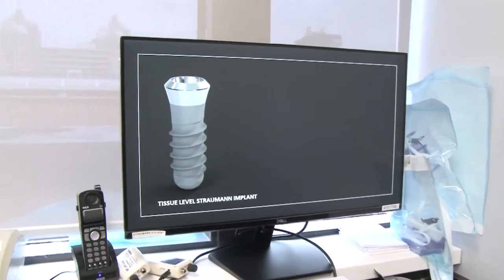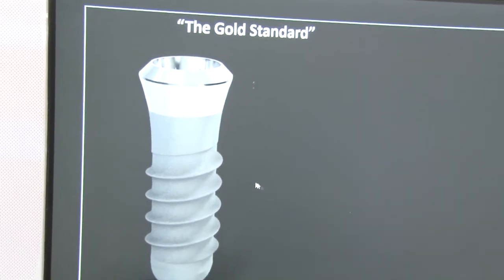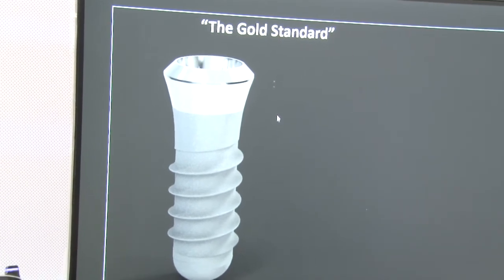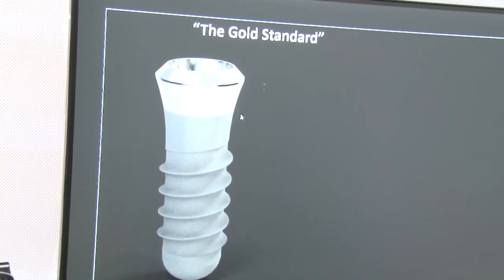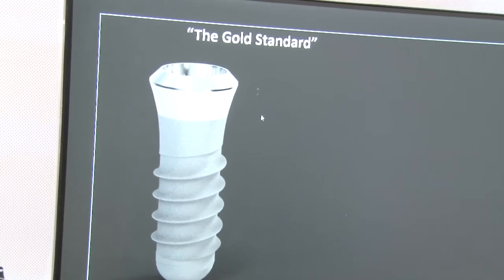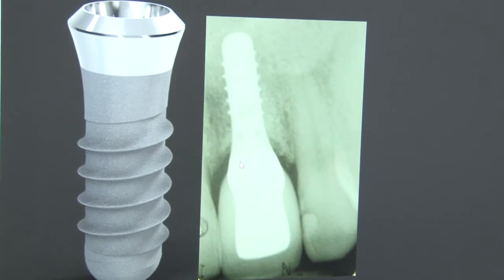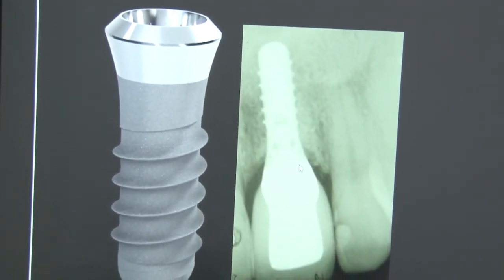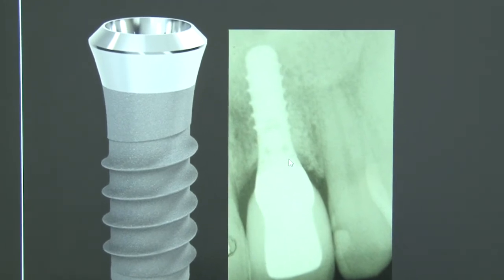The next thing I want to talk to you about is the comparison of the tissue level implant to the BLX implant. Take a look at this view over here. The tissue level implant has always been known as the gold standard in Straumann implant dentistry. The reason being that the interface between the coronal surface and the implant itself is remote from the alveolar crest, where the roughened surface of the implant meets the alveolar crest. If you take a look at a radiograph for a patient who has a TLX implant, even in the aesthetic zone, you can see that by placing the finish line of the crown remote from the roughened surface, it promotes good bone to roughened surface at the alveolar crest.